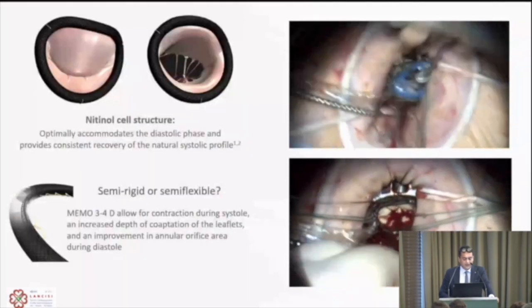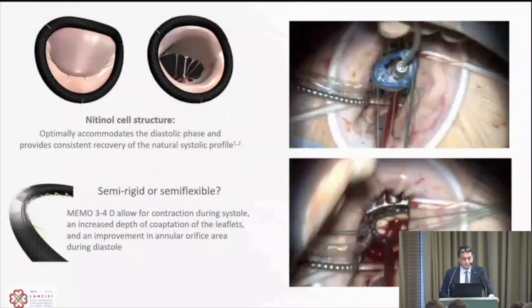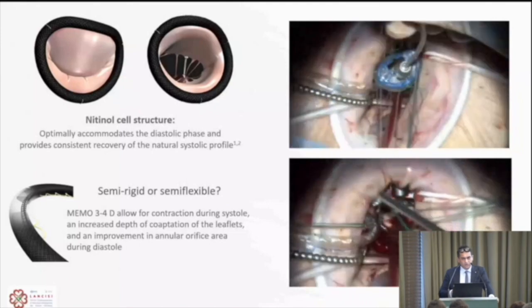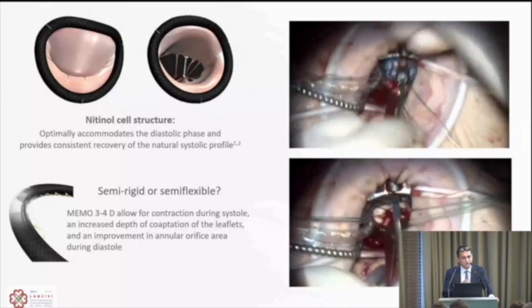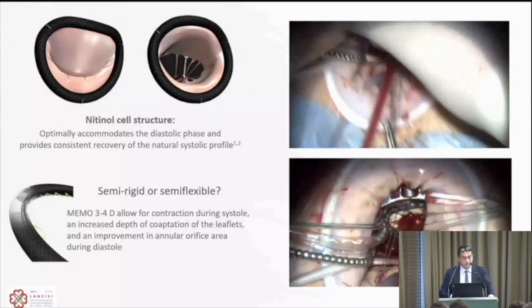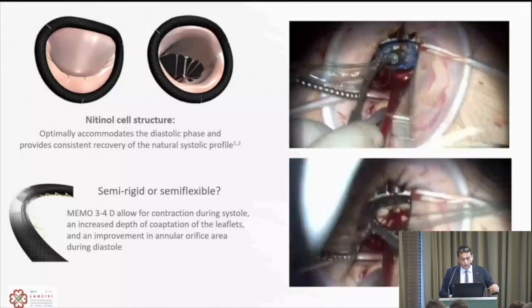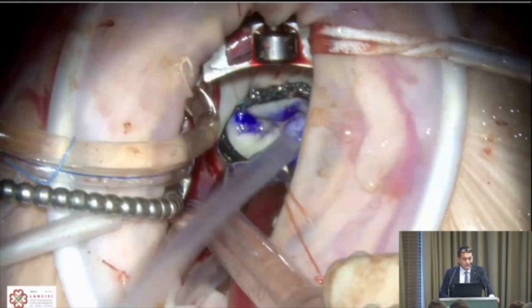We use the Memo ring. What I like about this ring is the nitinol cell structure: it is semi-rigid but more flexible than other semi-rigid rings, with the potential to offer better diastolic function by increasing the annular orifice. It follows cardiac contraction, increasing the length of leaflet coaptation after repair. The final water test shows no leaks — a nicely working valve.